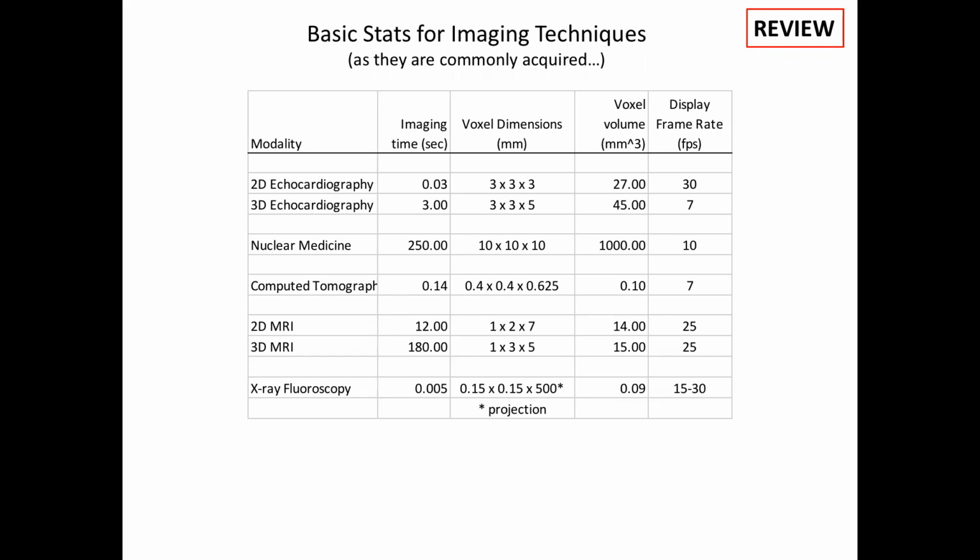Now, if you wanted data at 100 frames a second, you can always go back and click through frames and make measurements, right? And that is truly at 100 frames a second. So now I'm just going to click frame to frame, do a segmentation on, say, a valve leaflet, and see where that leaflet moves in that 100th of a second, right? So that's achievable.